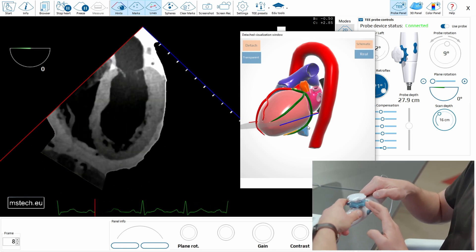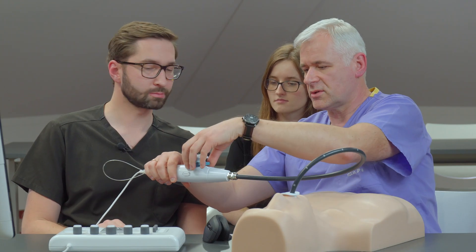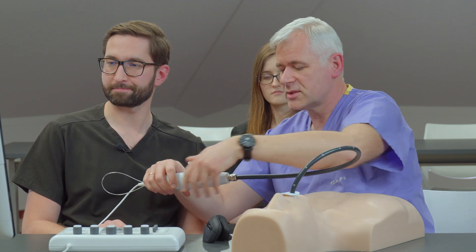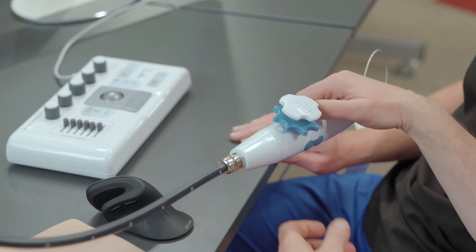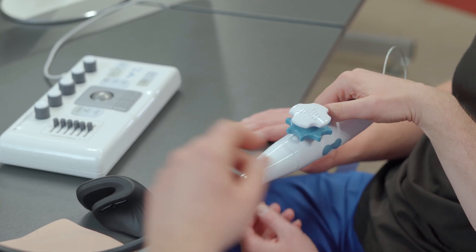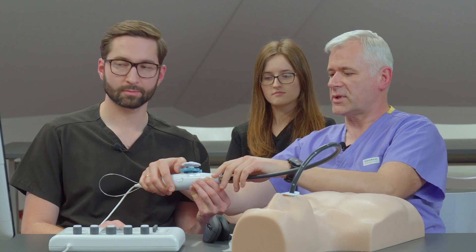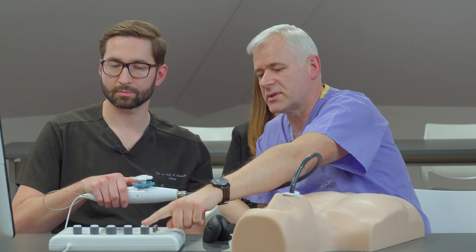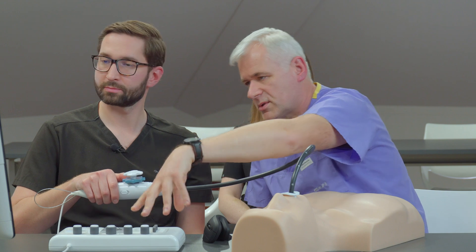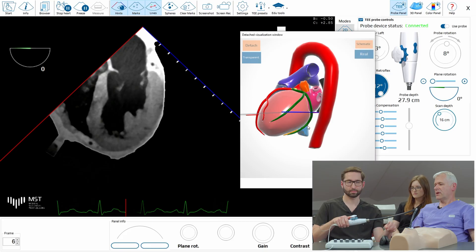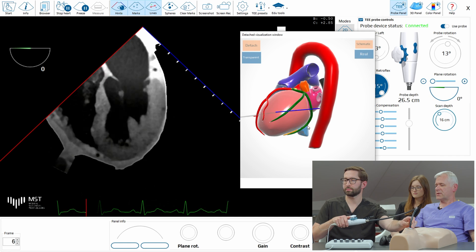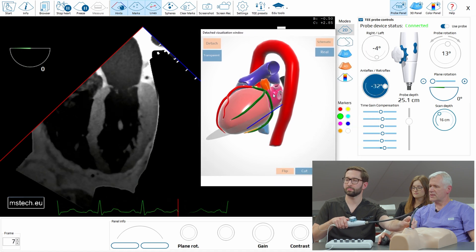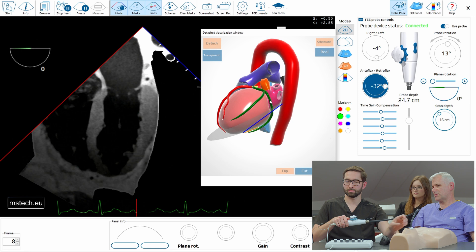If you manipulate this knob, you can use your left hand, but then you have no hand to manipulate here or there. My advice would be to use your thumb to really control the big wheel here, and then you have the left hand completely free. If you control the stick angle with the knob instead of the buttons, then everything you do, you do on the keyboard of the machine. But this is not yet retroflexed really — we have to wait a little bit to stabilize the image sometimes.